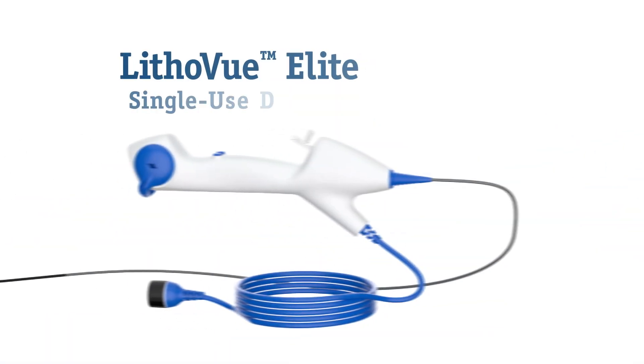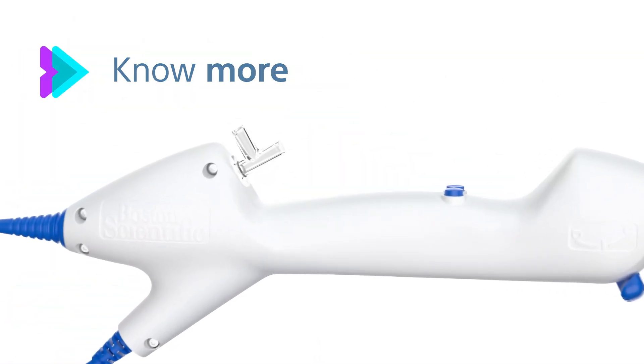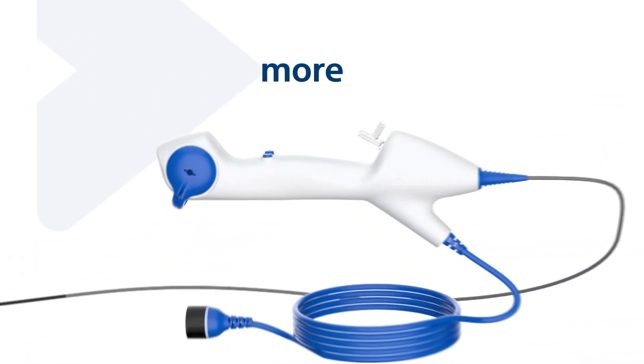The Lithaview Elite single-use digital flexible ureteroscope — use it to upgrade your OR so you can see more, know more, do more. Because it's not just an ordinary scope. It's more.